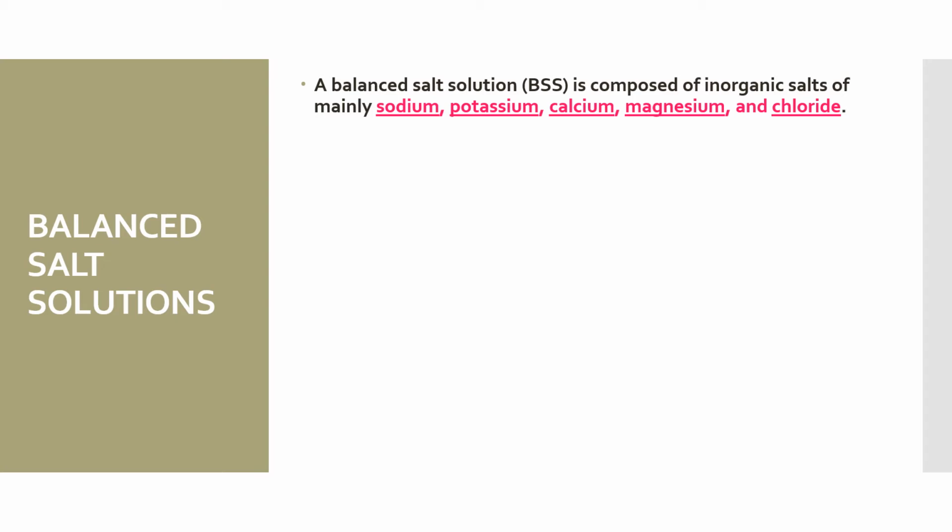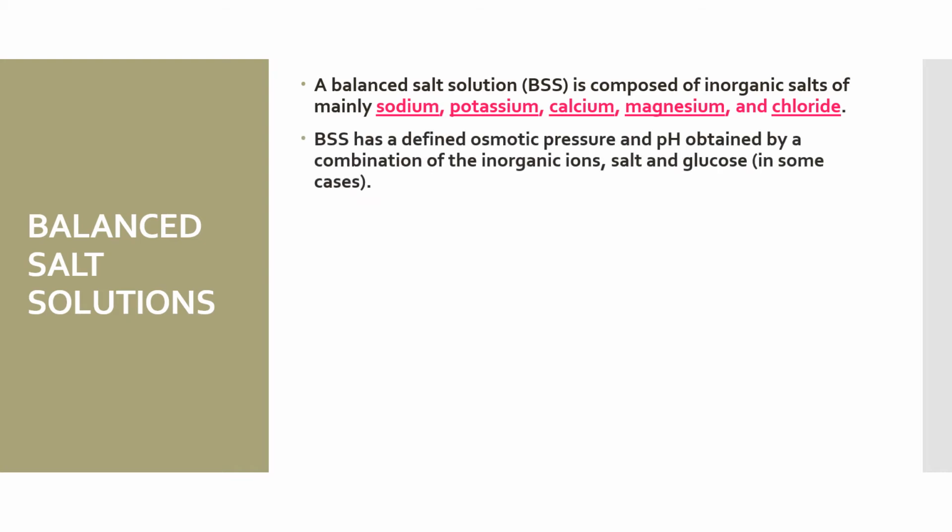So a balanced salt solution is composed of inorganic salts of mainly sodium, potassium, calcium, magnesium, and chloride. Balanced salt solution has a defined osmotic pressure and pH, which is obtained by a combination of the inorganic ions, salt, and glucose.